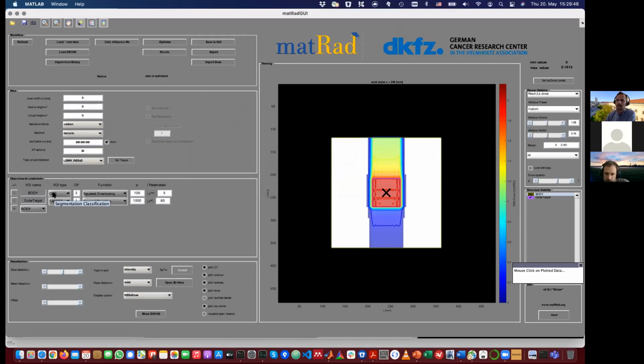So there are non-linearities in the trade-off that might occur. They are very small, but numerically the two results are not the same.